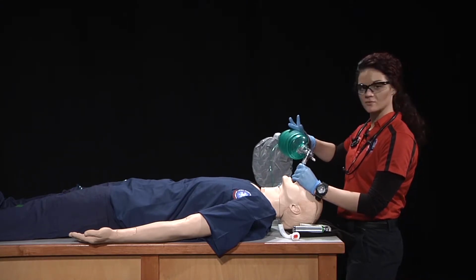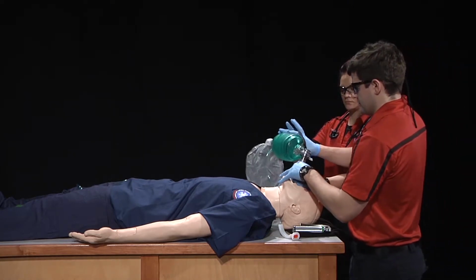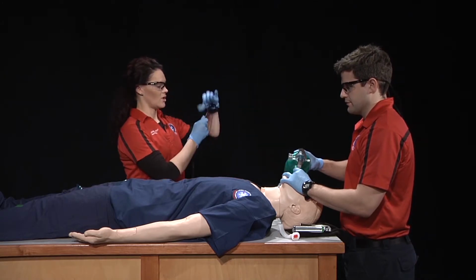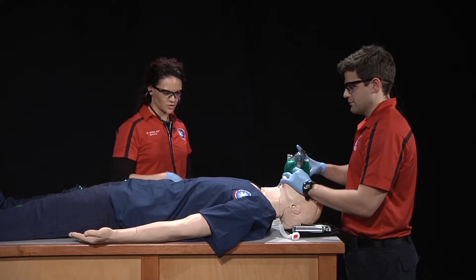I'll now have my partner resume ventilations. And I will auscultate bilaterally over the lungs and epigastrium to confirm tube placement.